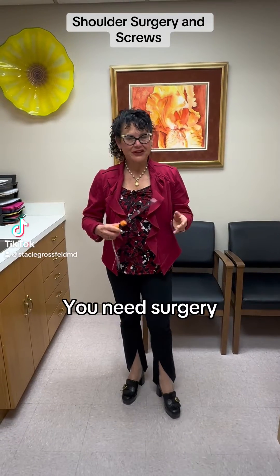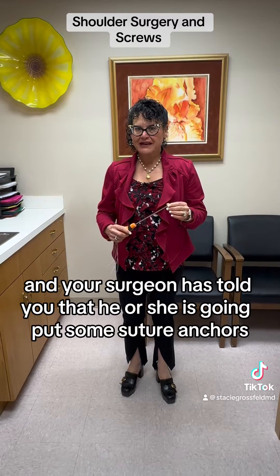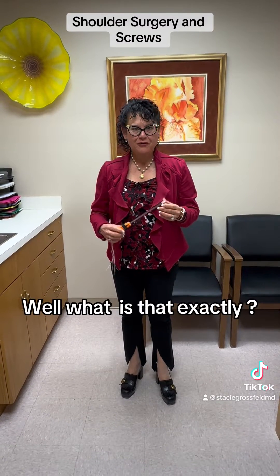You've torn your rotator cuff, you need surgery, and your surgeon has told you that he or she is going to put some suture anchors or screws in your shoulder. What is that?